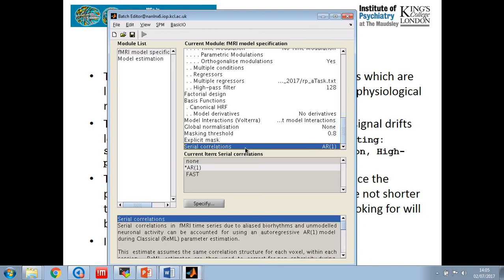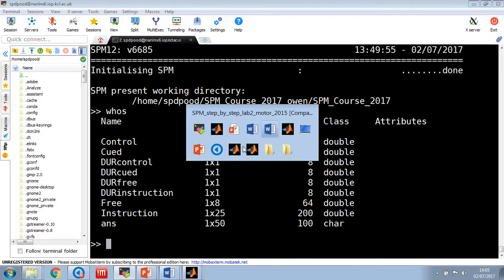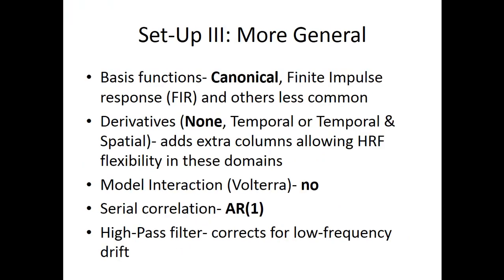And basically, one of the problems and one of the assumptions in the analysis is that the error terms, if I can go to my slides, so I've gone too far. I think I've got something in this. Come back to the high pass filter, autocorrelation, yeah.